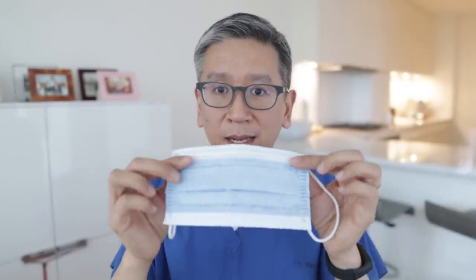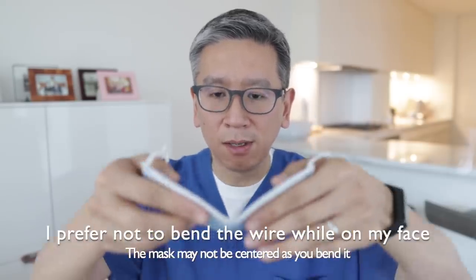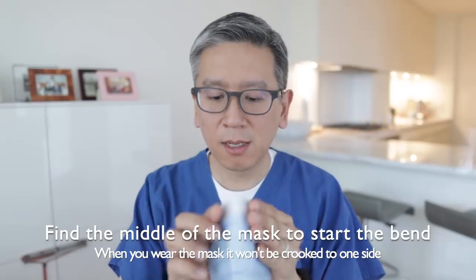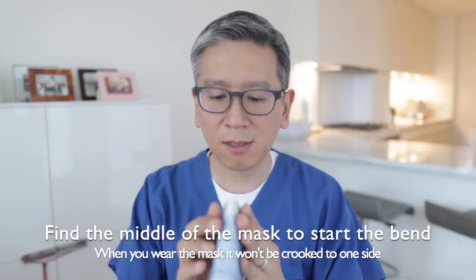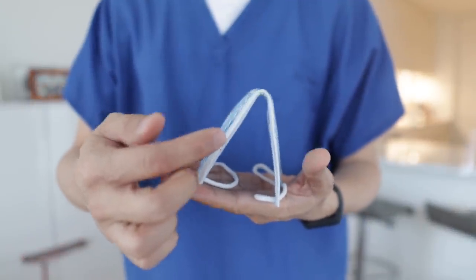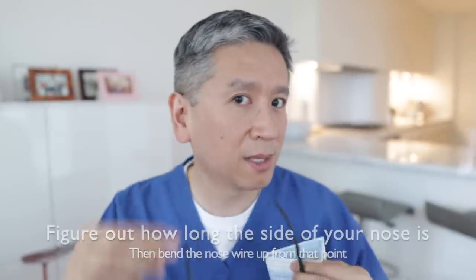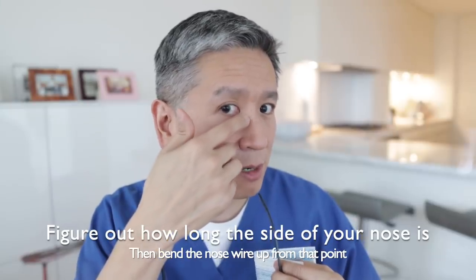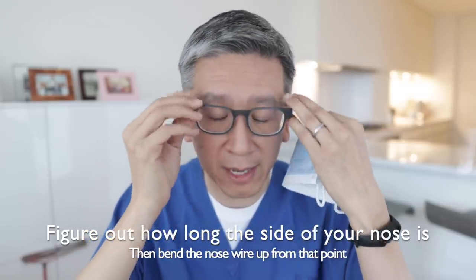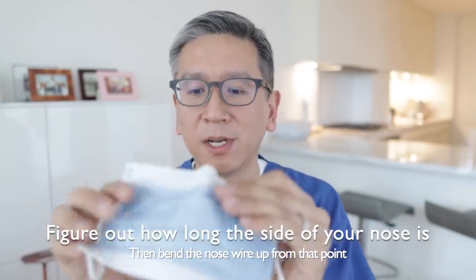I like to pre-bend my mask at the nose wire before going into surgery. I find the middle and bend the mask so it's nice and straight — otherwise it'll be crooked on your face. Everyone's nose is different, so you have to determine the side wall of your nose. If your nose is a little flatter, you might bend it like this. But if your nose is a little bigger, you might bend it a little further down.